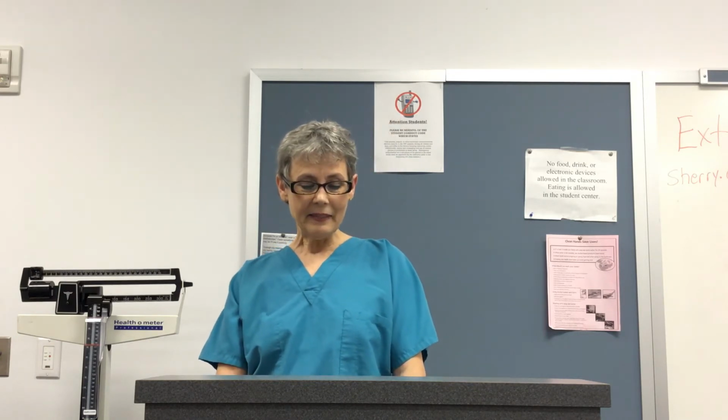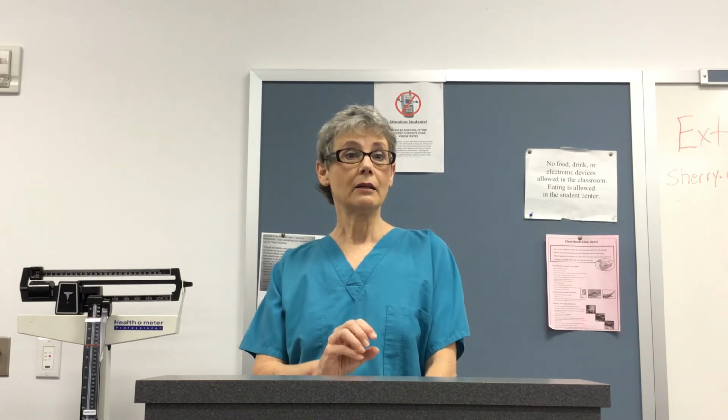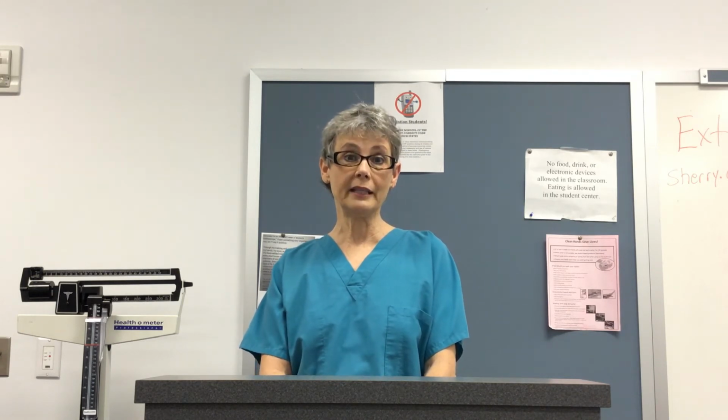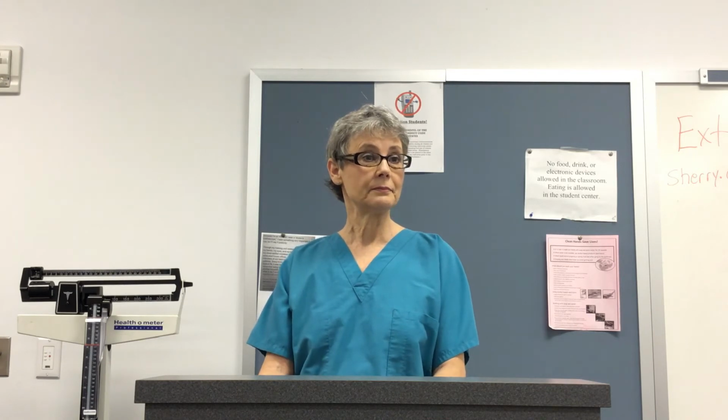Hematomas. Now this may happen if you blow the vein, and you'll have bleeding under the skin. You'll get a little knot that comes up, and this happens if you've got a fragile vein, and when you stick that needle into that vein and it's under pressure and it's fragile, like I said, it can rupture, and then you're going to have bleeding. So you want to apply pressure to that as soon as possible. Of course, remove the catheter.